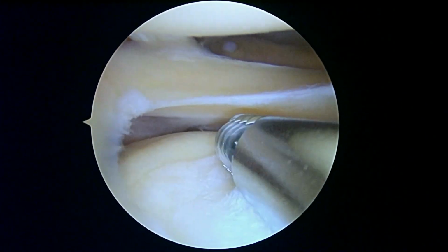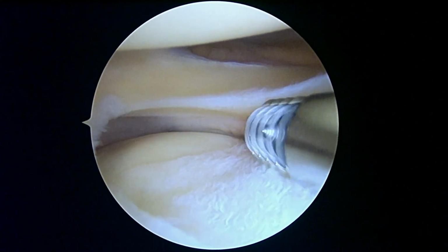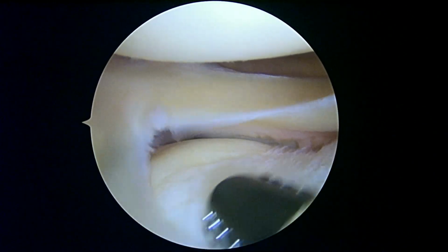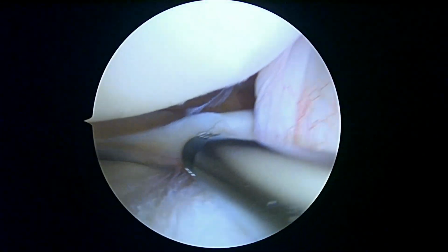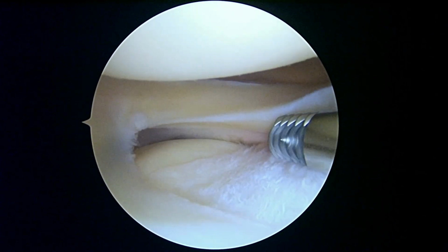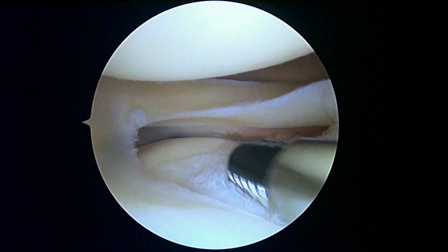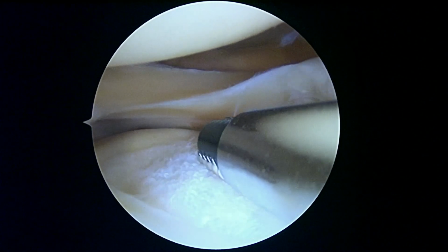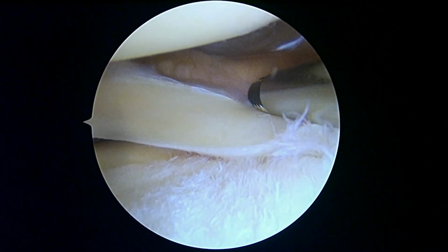Okay, so now we're looking in the lateral compartment. There's some really small little loose pieces of cartilage, probably coming from this tibial plateau. You can see how this is a little bit scuffed up. The femoral condyle up above looks like it's in better shape, but the plateau is not so much. Just a sign of early arthritis, another reason why we're doing the PRP injection. You can see how it's a little bit soft. I don't see anything else grossly loose. As far as the meniscus goes, this posterior horn looks great.